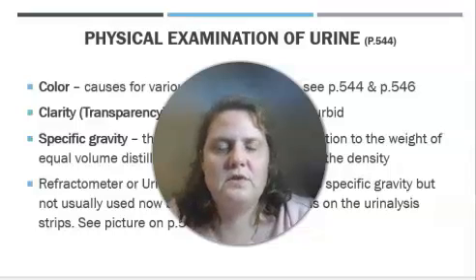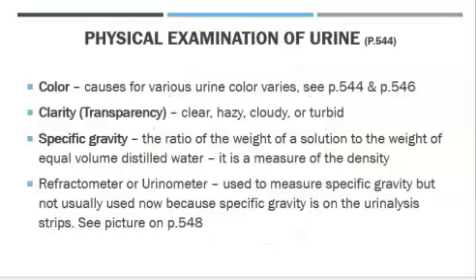Welcome back to part 2 of the urinalysis lecture for MLT 110. The first thing that we need to discuss is the physical examination of urine.